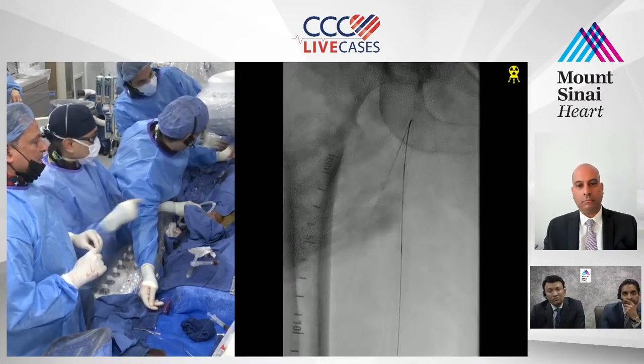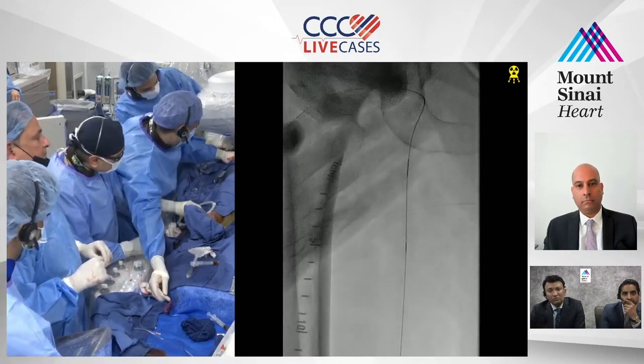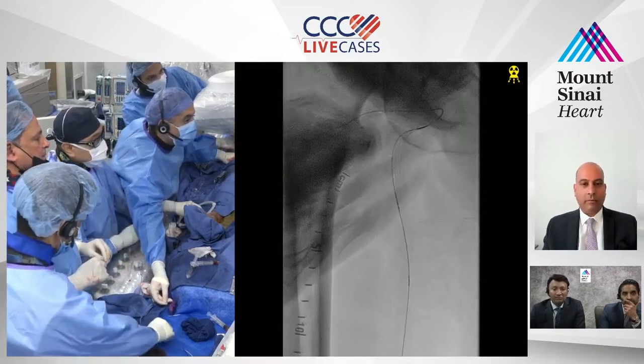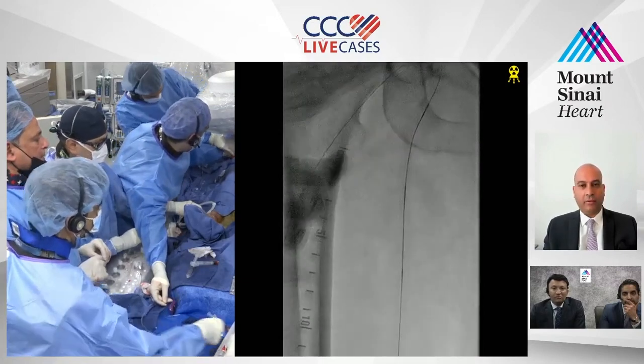Hold on, let me give you a little bit of... Watch it, please. Yeah, sorry. Hold on. Is it going or no? I just need a dry rate tech here. Okay, we're in the artery. Oh, you're definitely in the artery. It's just the way it kinks. Hold on, let me give you a little bit of support with the tissue.